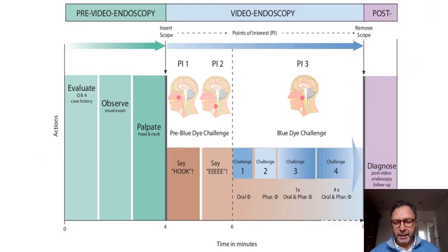So basically, the examination of a dysphagic patient, dysphagia being a symptom, has to be, well, the technical issues have to be preceded by a good evaluation of the medical history of the patient, a good anamnesis, questions that are well asked and oriented, and of course a good observation of your patient and even palpating the neck. This being done, we can skip over to the next point, which is the video endoscopy.